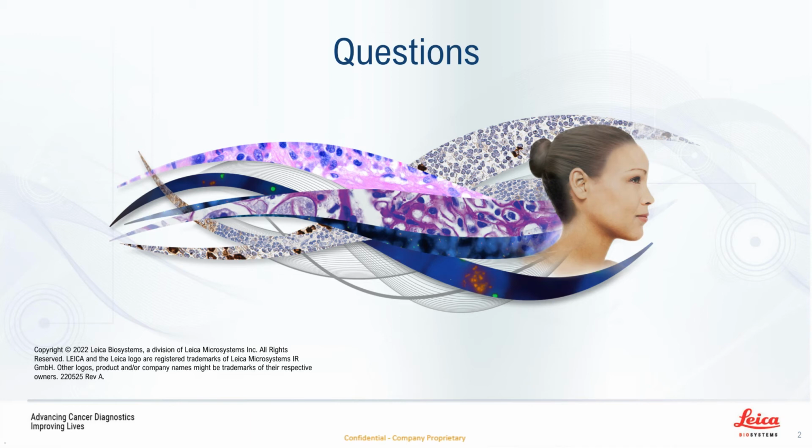All right, thank you. Next question. Is color standardization really important? Don't pathologists just naturally adjust for differences in staining, such as H&E? Yes, I think that this is a very interesting one and one that could lead us to hours of debate around the topic. And yes, the human eye and pathologists and reviewers will naturally white balance or adjust their eye for changes in staining.